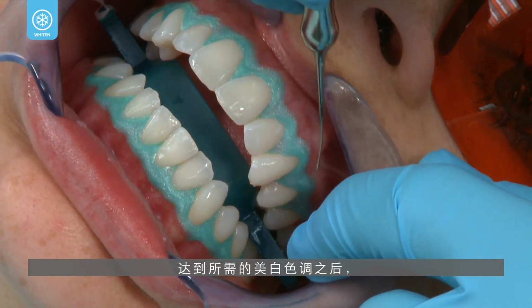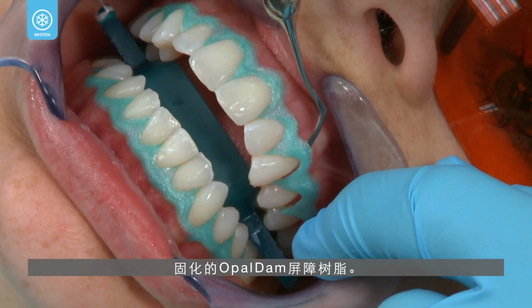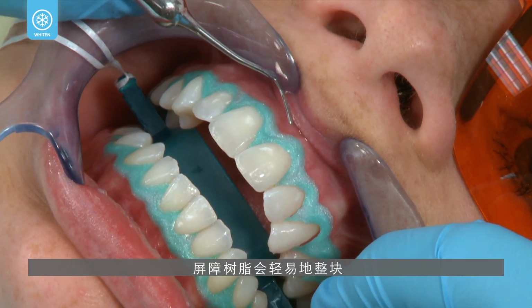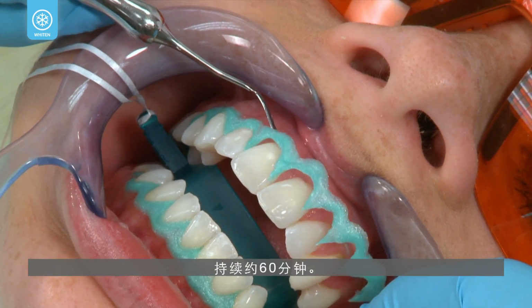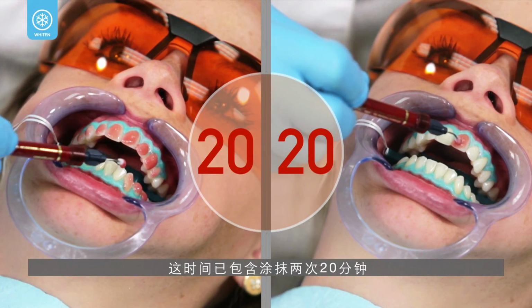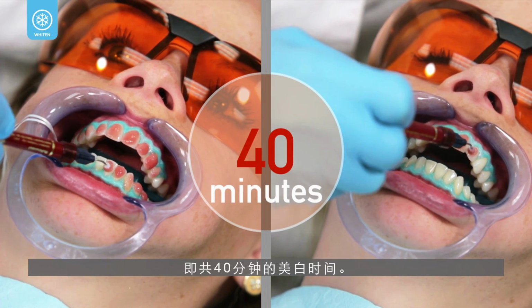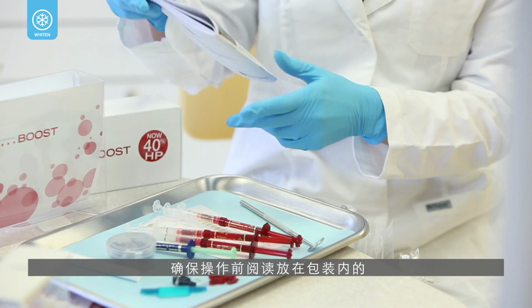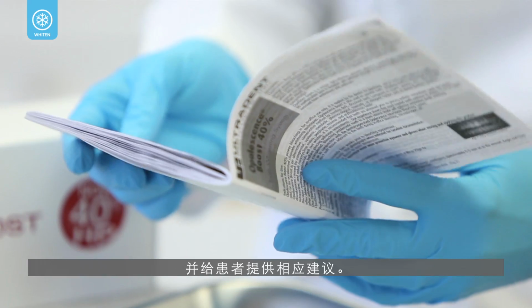Once the desired shade of white is achieved, use a dental instrument to remove the cured Opaldam resin barrier. It will easily come off in 1 or more large pieces. The total procedure, including setup and isolation, typically lasts 60 minutes. This includes 2 20-minute applications of Opalescence Boost for a total of 40 minutes of whitening time. Be certain to read the product instructions, warnings, and information for the patient contained in the package, and advise the patient accordingly.